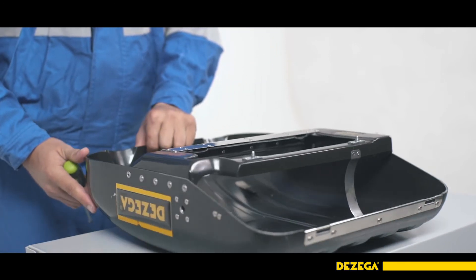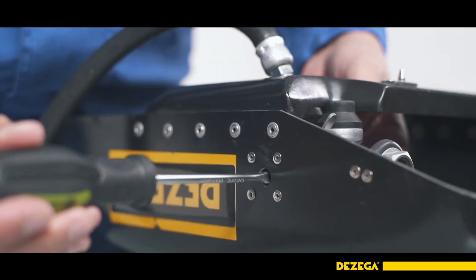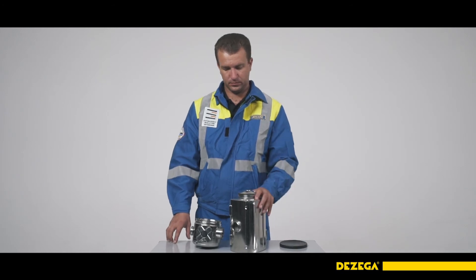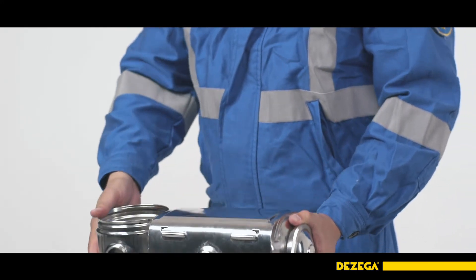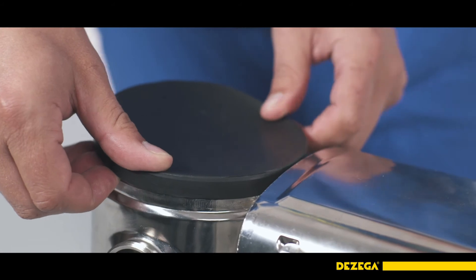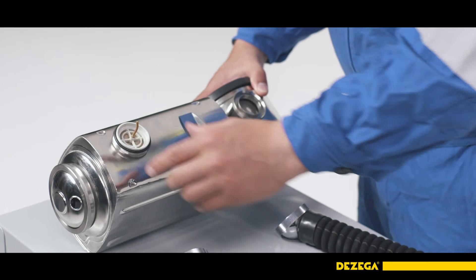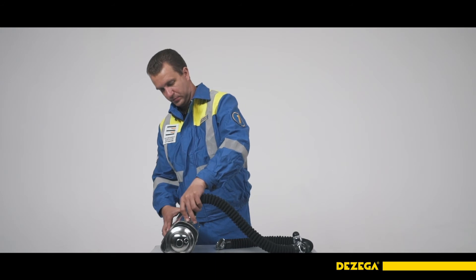Reassemble the breathing apparatus in reverse order. If the oxygen distribution unit was removed during disassembly, install the unit with a signal device and a capillary tube with a pressure gauge into the protective case, then screw in the screw with a wasted shank. Connect the cooler to the regenerative cartridge by making the bayonet connection with a displacement of 45 degrees and turning the cooler clockwise against the axis of connection all the way in. Put the lid on the cooler — use the lid during operation only with an ice pack. Install the inhalation and exhalation valves into the cooler and the regenerative cartridge; the design of the valves prevents incorrect installation. Connect the breathing hoses to the cooler and the regenerative cartridge.